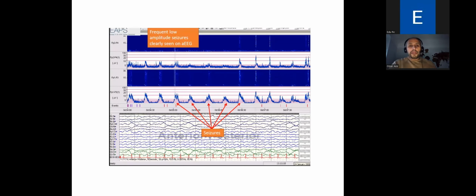Again, this actually is quite a nasty CFAM because the underlying activity is so suppressed, so low. But then when you're getting activity, it looks like seizures. So this brain is very much compromised from that point of view. So it's either seizing or completely flat.